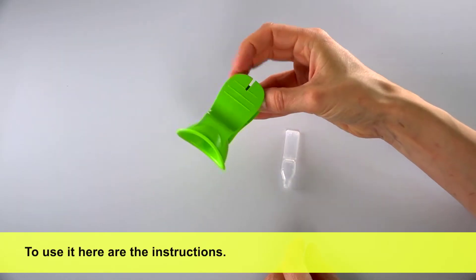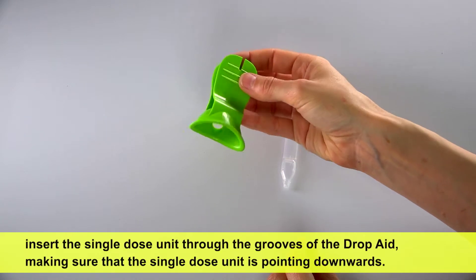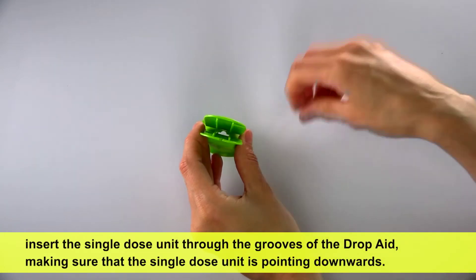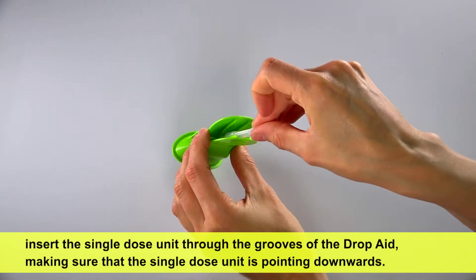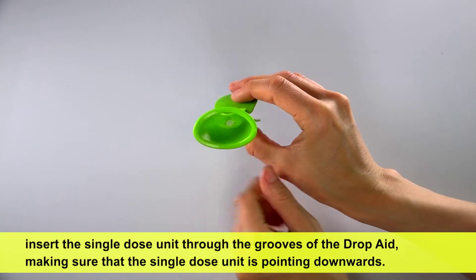To use it, here are the instructions. Twist off the cap of the single dose unit. Insert the single dose unit through the grooves of the DropAid, making sure that the single dose unit is pointing downwards.